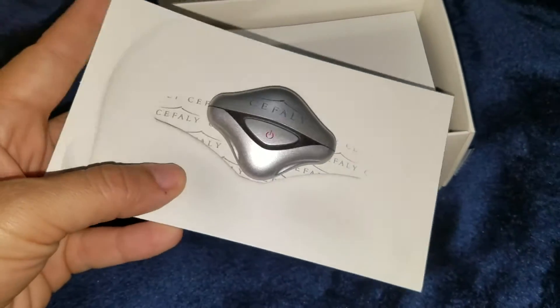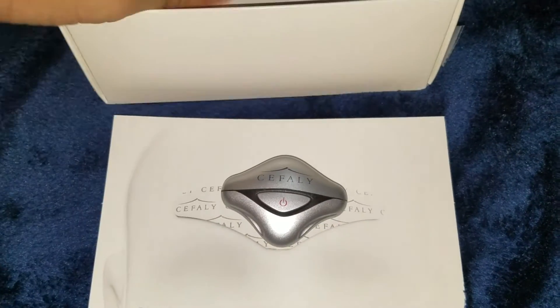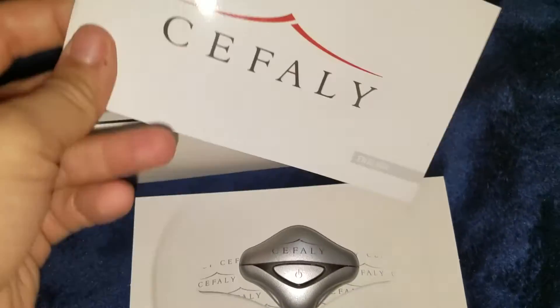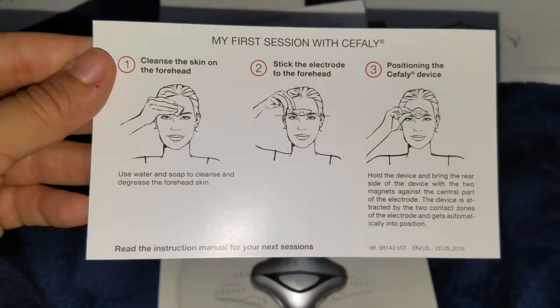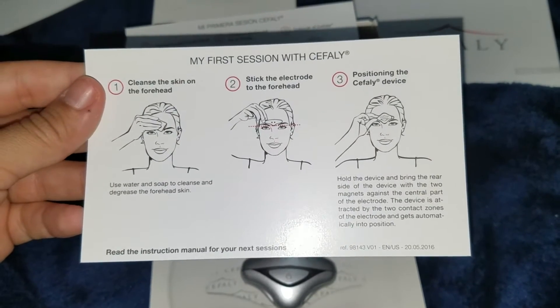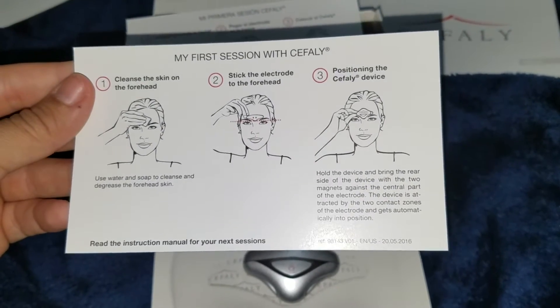So the device itself is actually pretty small — I was surprised at how small it was. This is the second version of their device, I believe, so it's a lot smaller and compact. It comes with instruction manuals for English and Spanish, and it comes with an instruction card, which is actually pretty helpful. I would keep that one in the little case.